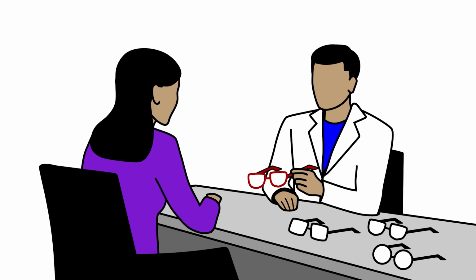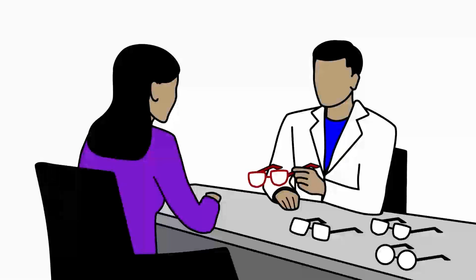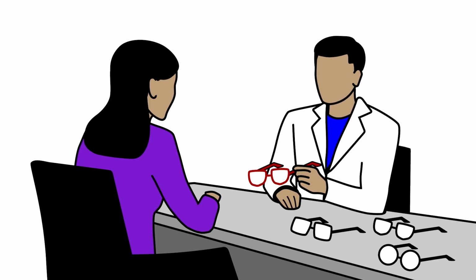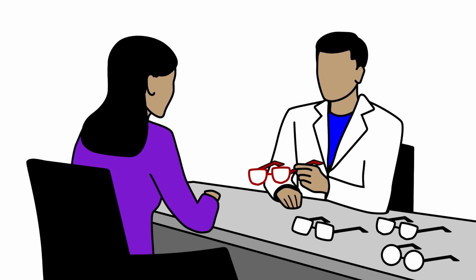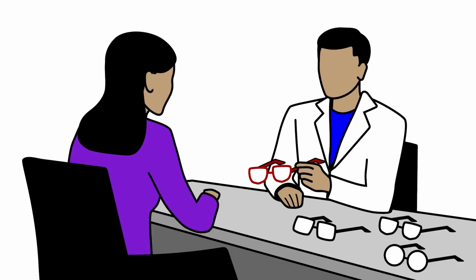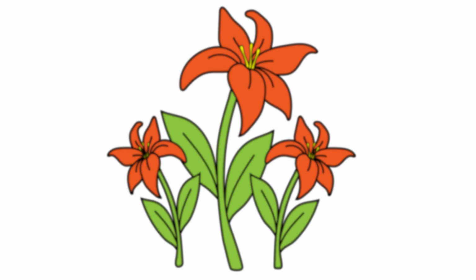Knowing how clearly and accurately you can see things far away can help your doctor make suggestions for glasses or contact lenses or a change in your current prescription. It also helps you understand why you might not always see things that someone else is pointing out and how close you might want to get to see them better. This test is usually done as part of your regular yearly eye exam, and it may be done more often if you notice changes in your vision or if your glasses don't seem to be working well.